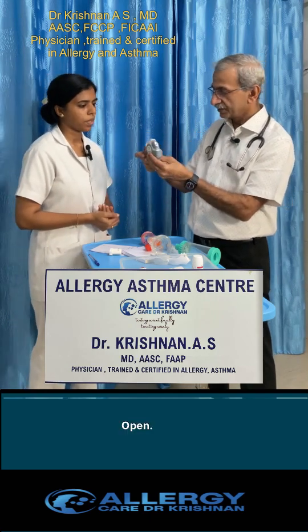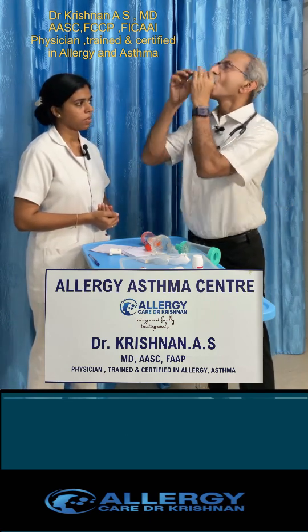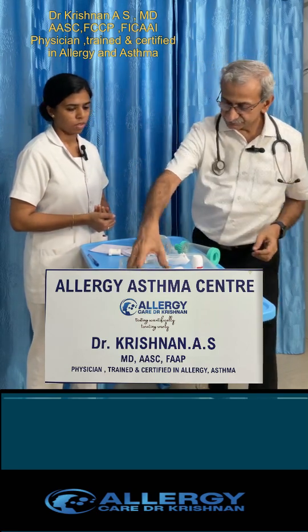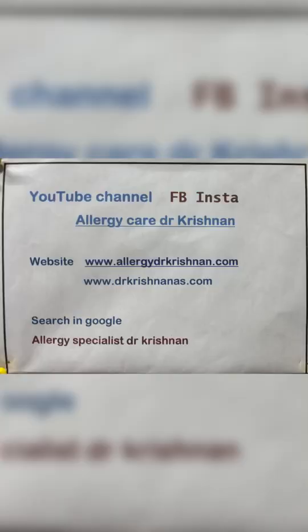I'll show you once again — open. I'm Dr. Krishnan at the Allergy Asthma Centre, Kochi, Krishna Hospital.